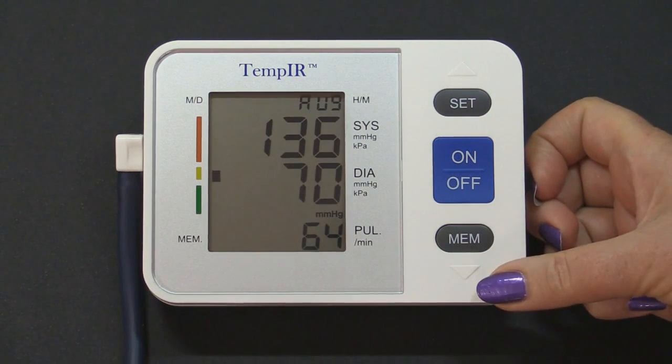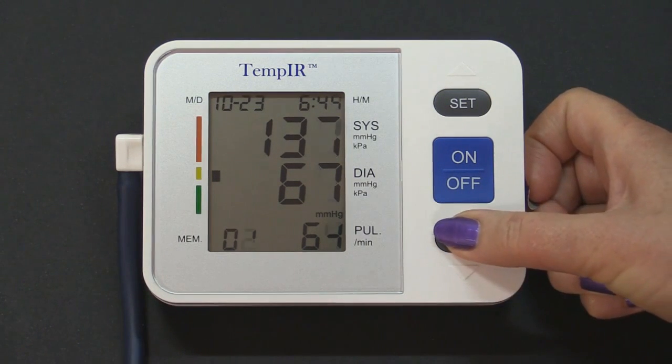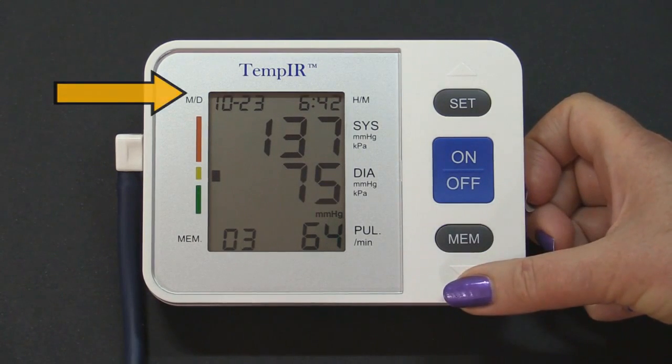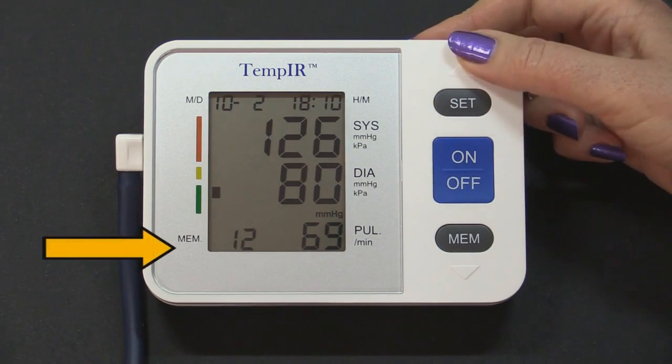Press the MEM button once. The first result displayed is the average of the latest 3 readings. Press MEM once again for the latest reading. Each press on the MEM button will display the previous reading — the date and time are displayed at the top. Pressing the SET button will display the results in reverse order, with the highest number being the first reading taken.